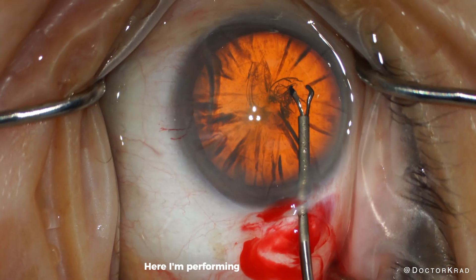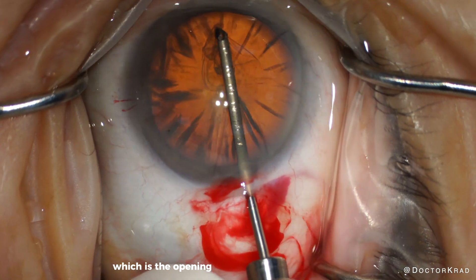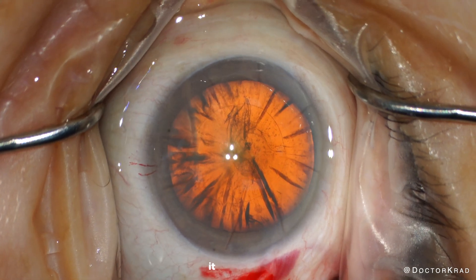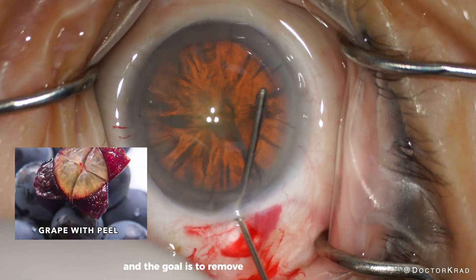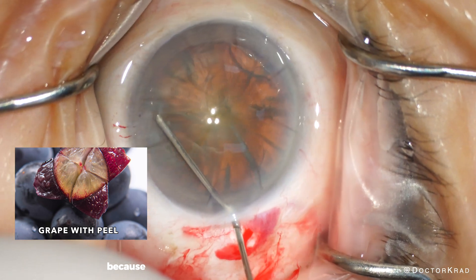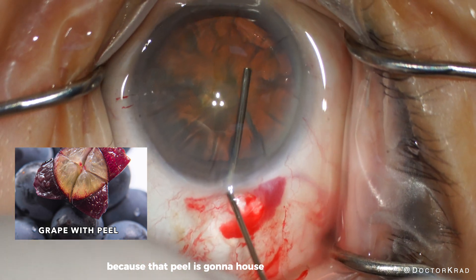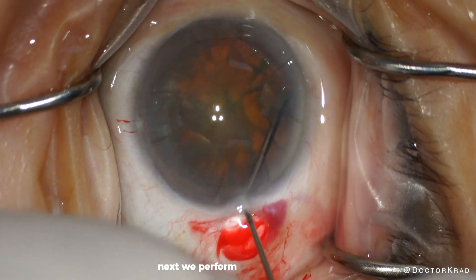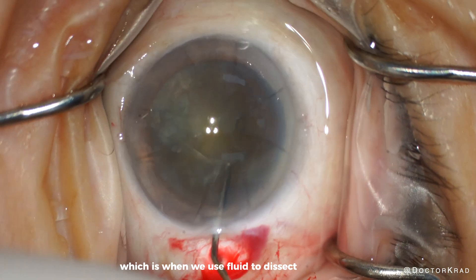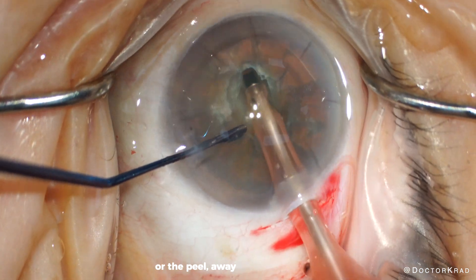Here, I'm performing the capsulorhexis, which is the opening in the capsule of the cataract. If you think of the cataract like a grape, it has a peel and the goal is to remove the inside of the grape and retain the peel, because that peel is going to house the new lens implant. Next, we perform hydrodissection, which is when we use fluid to dissect the capsule or the peel away from the cataract.